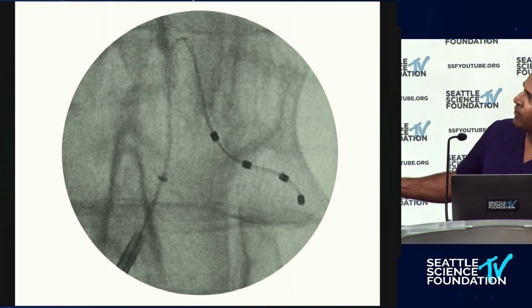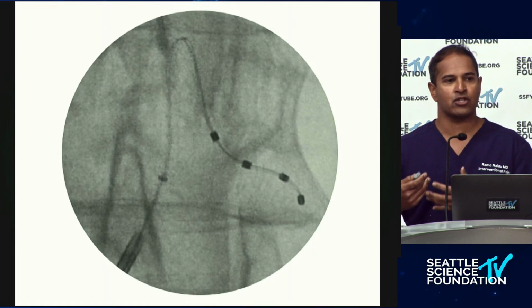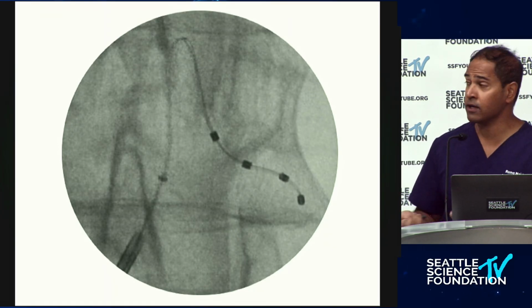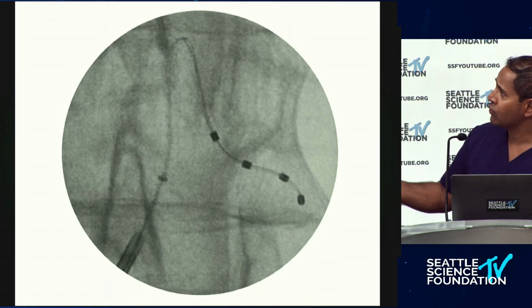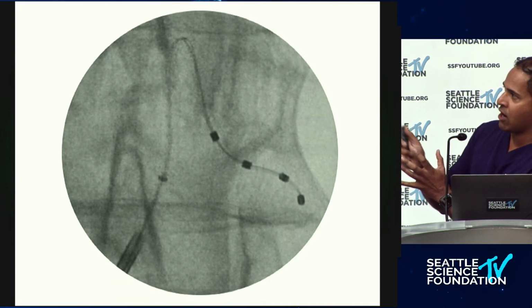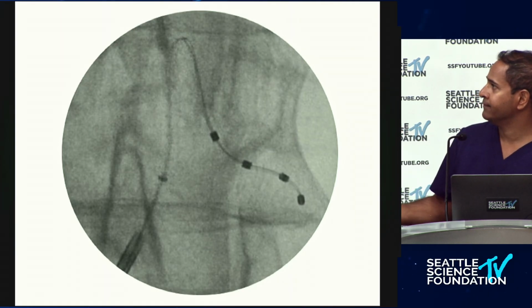So when we first taught people how to do this, we just talked about doing one cephalad loop. But now what we're really looking for are M's and W's, having 3 inflection points. Because if you think about it, it's like a spring. The more turns of the spring you have, the more mechanical energy you can put into the spring. Same idea here. So rather than having 2 inflection points, we encourage 3. And so if the patient starts moving, twisting, or whatever else, the energy now springs in the epidural space rather than forcing the lead or the electrodes to move out of the neuroforamen.